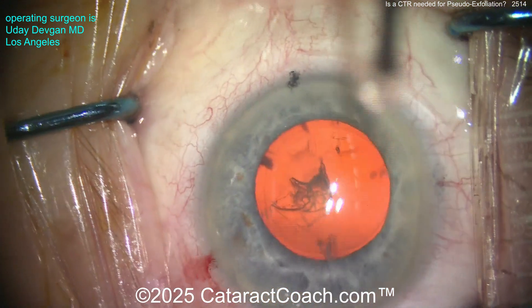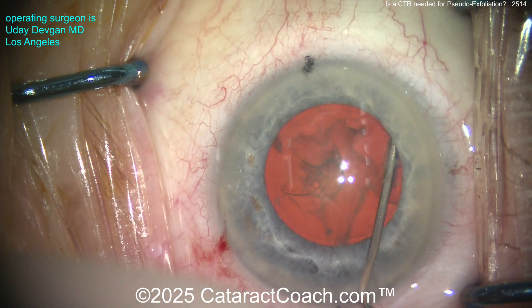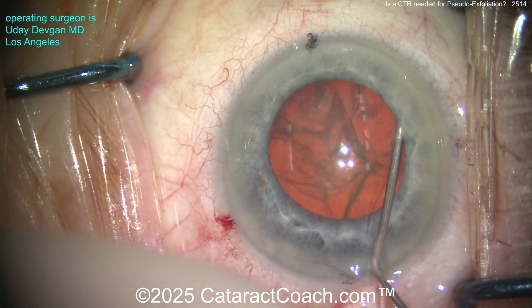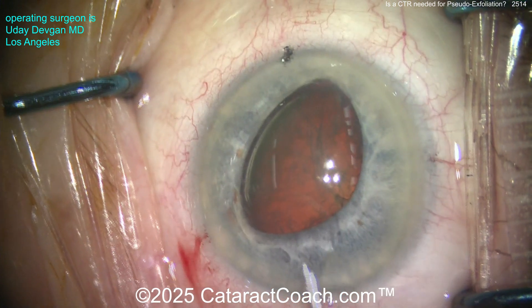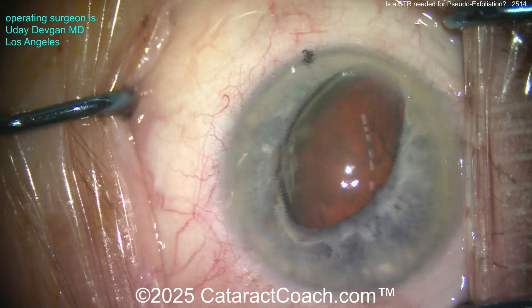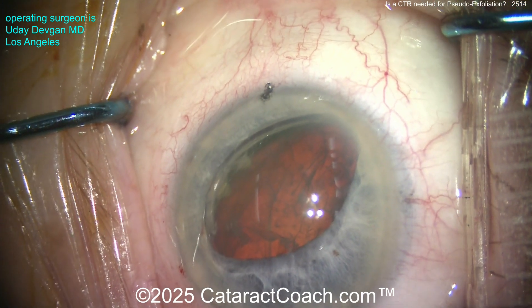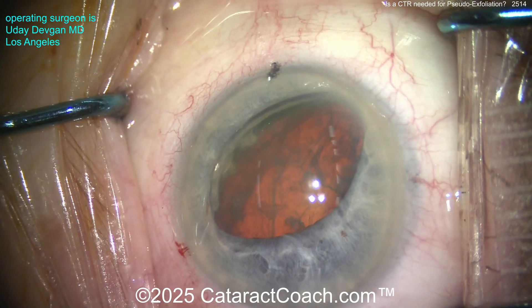How am I going to remove the nucleus? This patient has a normal axial length — IOL power is about 20 diopters. If you're worried about zonular integrity, let's not operate entirely in the bag. So I tilt the nucleus partially out of the bag — it's half in the bag, half out — and look how the pupil is holding the nucleus for me.